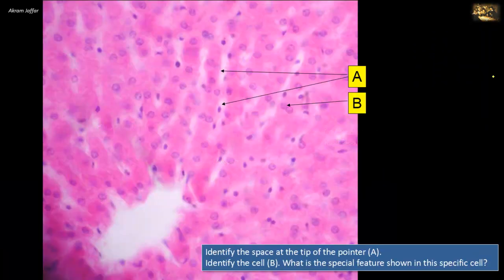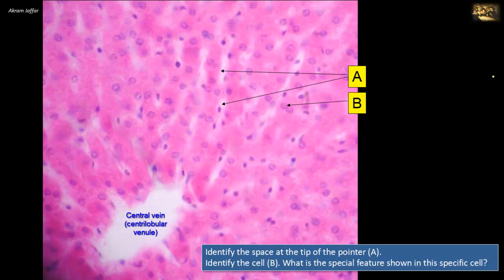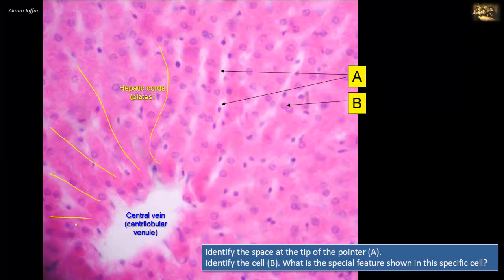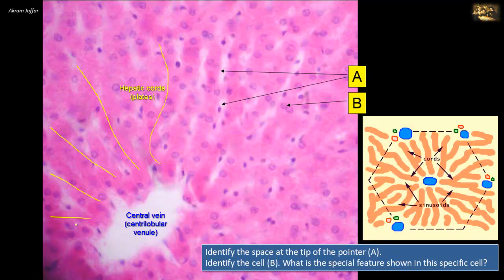Identify the space at the tip of pointer A and identify cell B. What is the special feature shown in this specific cell? This section shows the classical structural unit of the liver — the hepatic lobule — with a centrilobular venule (central vein), a tributary of the hepatic vein, located in the center of the lobule. The hepatocytes form plates or hepatic cords radiating around the central vein. In between the cords are sinusoids — white vascular spaces or capillaries marked as A — lined by endothelium (simple squamous epithelium) represented by the flat cells.